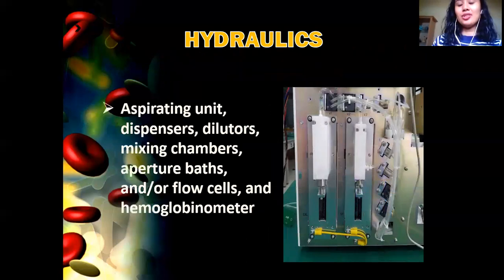So next, let's just define it. So what are hydraulics? So your hydraulics, I found a picture, something like this. So may mga aspiration, dispenser, dilutor, mixing chamber, aperture baths, ganyan. So may ganyang laman ang CBC natin.